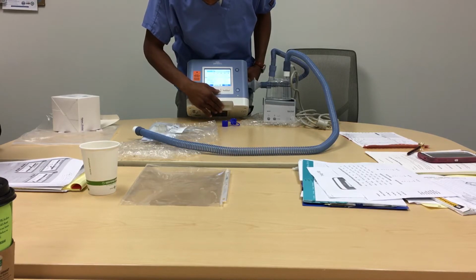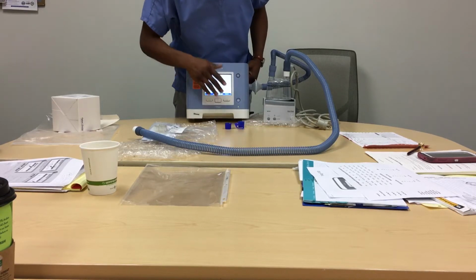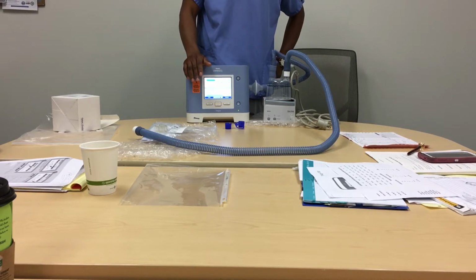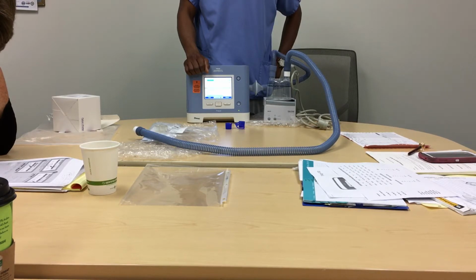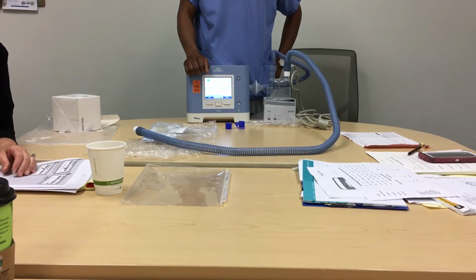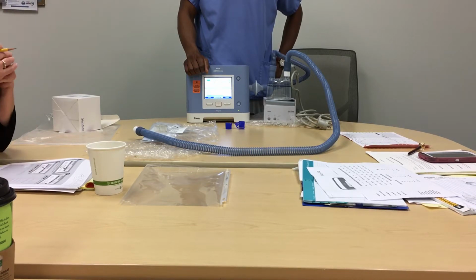My question is, because these patients are in-house and they're on BiPAP, who's doing the conversion for the settings from the BiPAP to the ASV when they go home? Dennis, you're doing that? Yes. Usually when there are patients in the hospital, you guys use the V60 in the hospital? Right, the V60. There's an option in there. We would try to educate all the hospital staff, all the RTs, about the V60. There's an option for AVAPS in there rather than the RT going back and forth to titrate it. If you use the AVAPS in there, it's an easy transition, but if you cannot do it, we will do it for you. Oh, okay. Yes. And the reason I asked them to come is because of that patient we had, and I had no idea what to tell the docs to write the prescriptions for.